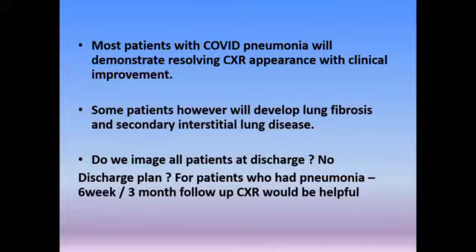Therefore, these consolidations will gradually resolve with residual interstitial thickening, what looks like fibrosis-like changes, and then you have to follow them up to see how these changes gradually resolve. Some patients take a few weeks to resolve.